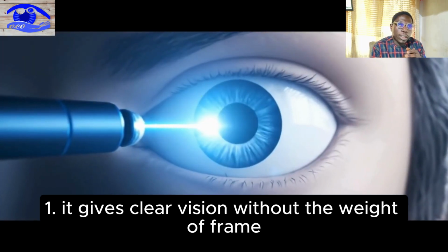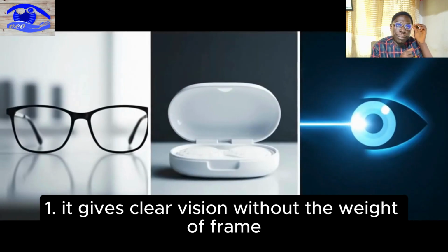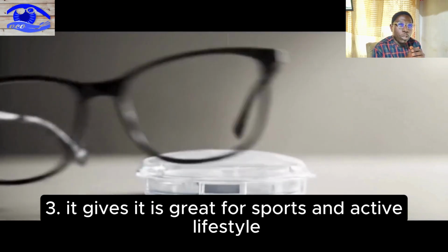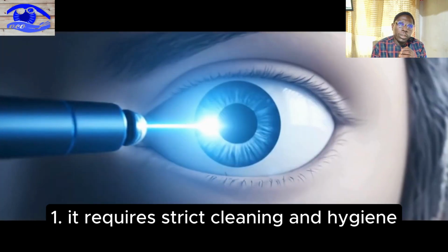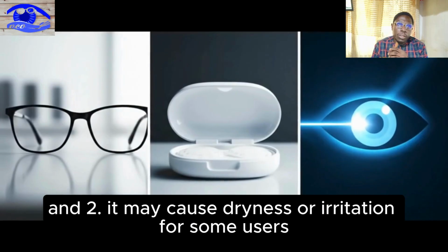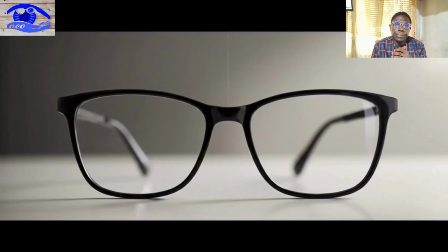Contact lenses give clear vision without the weight of a frame and better peripheral vision. They are great for sports and an active lifestyle. The cons: they require strict cleaning and hygiene, and may cause dryness or irritation for some users.